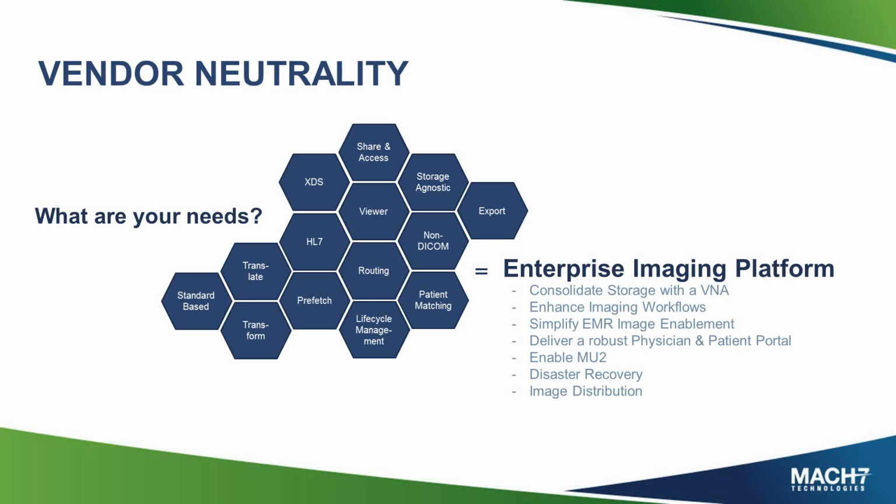It's also about receiving HL7 patient updates, for example. My wife changed her name. Let's make sure we update the database. Let's also make sure that imaging file gets updated when it leaves the vendor-neutral archive so that we don't have dirty data later.